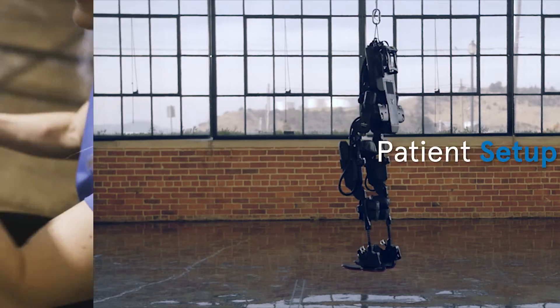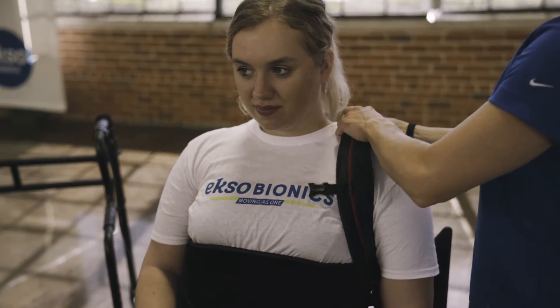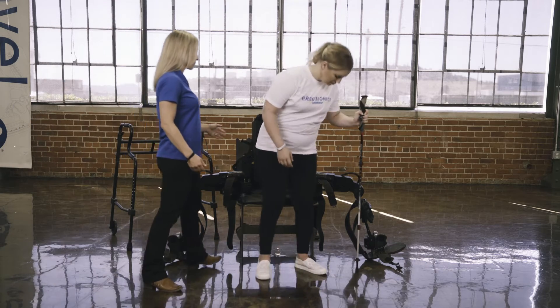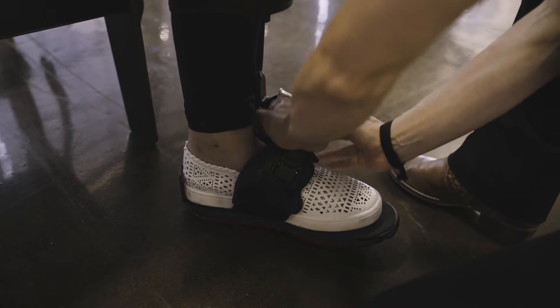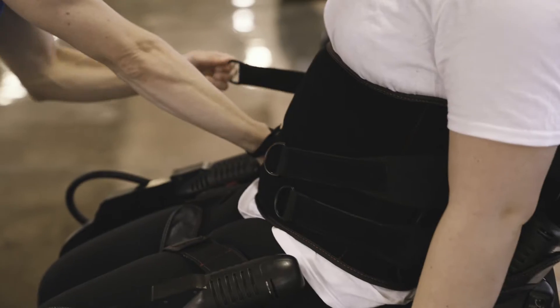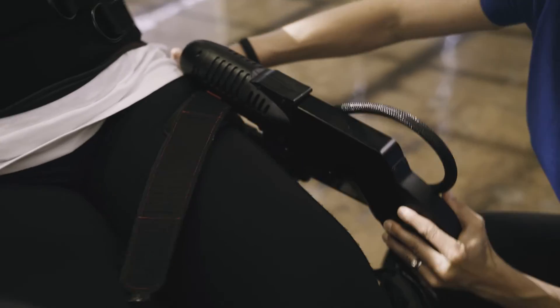Donning the device should take approximately five minutes, and involves choosing the appropriate fit kit items to make sure EXO will fit the patient comfortably and accurately. Putting EXO on involves having the patient transfer to the chair that EXO is sitting in and wrapping the EXO around the patient. There is a foot binding, a tibial brace, a thigh brace, a torso pad, and backpack straps to unite the EXO and patient. Doffing EXO happens more quickly and can be done in one to two minutes.